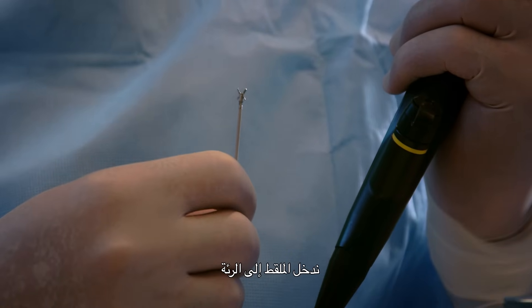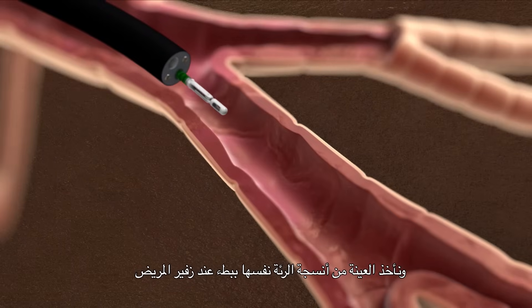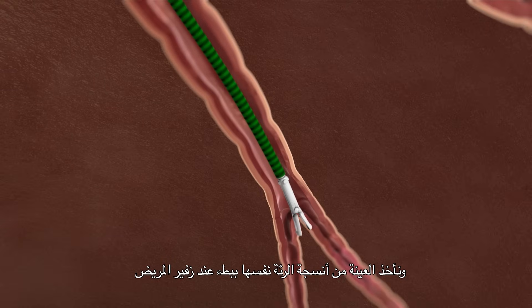At times where we suspect a disease of the lung tissue itself and want to get samples of the lung tissue, we will need to do a transbronchial biopsy. We pass the forceps deeper into the lung, then time the sampling so that when the patient is breathing out slowly, we take a bite of the lung tissue itself.